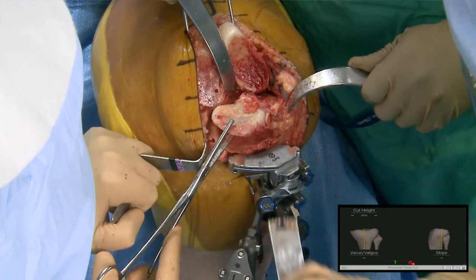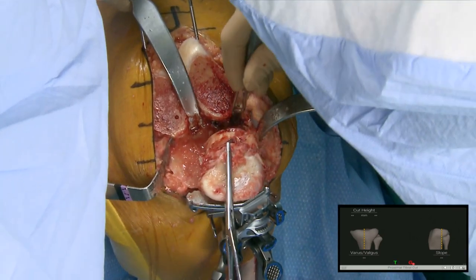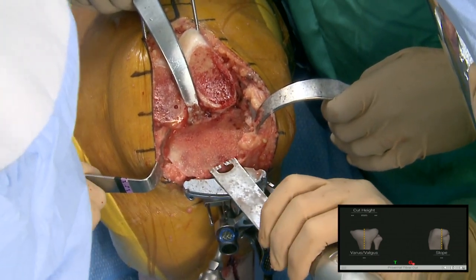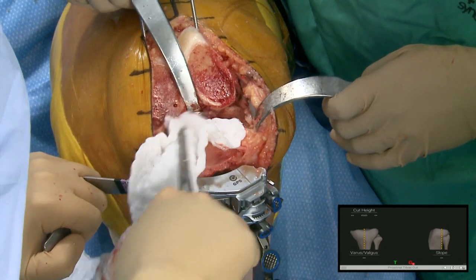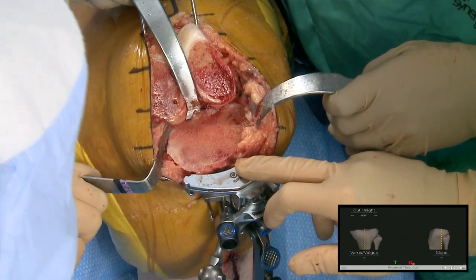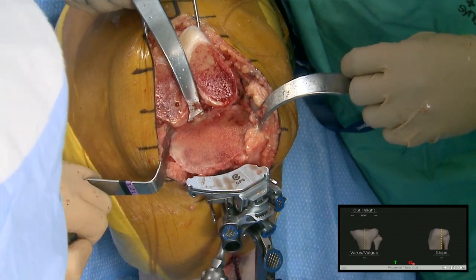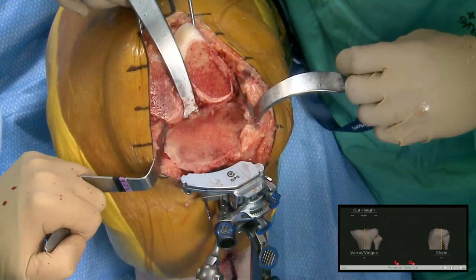I take out the PCL every single time. Why aim for three degrees of slope in this PS knee? Zero to three degrees is okay, but even if I aim for zero and the blade skies a little bit as I'm cutting, I might end up with reverse slope and I don't want that. I'm okay with three degrees, but typically as we saw with flexion-extension, it's more likely to sky the other way — I might end up with one or two degrees of posterior slope, which I'm fine with.